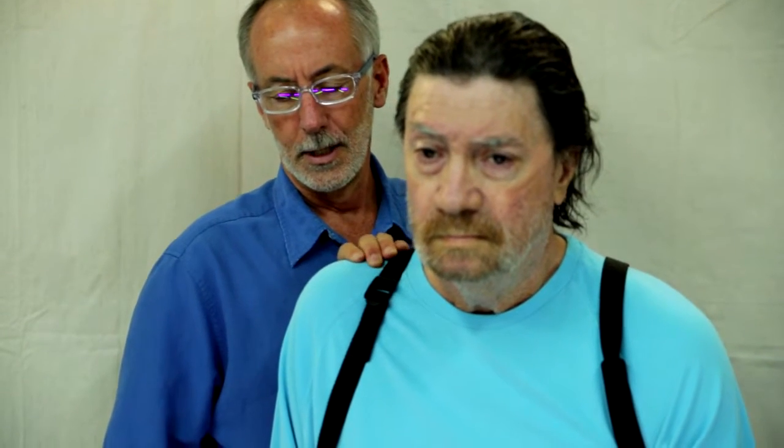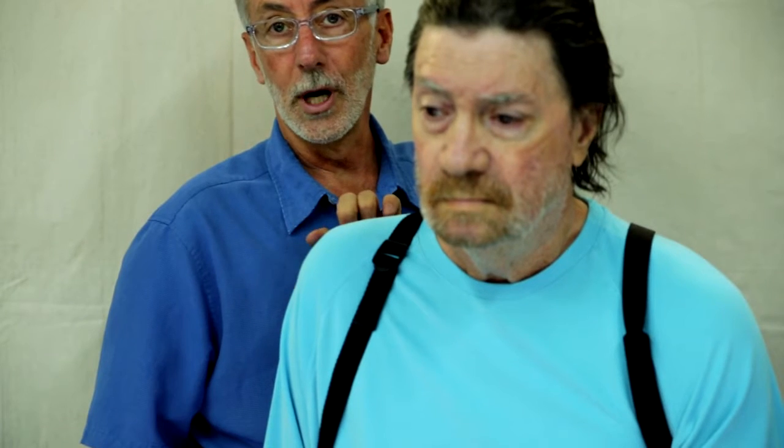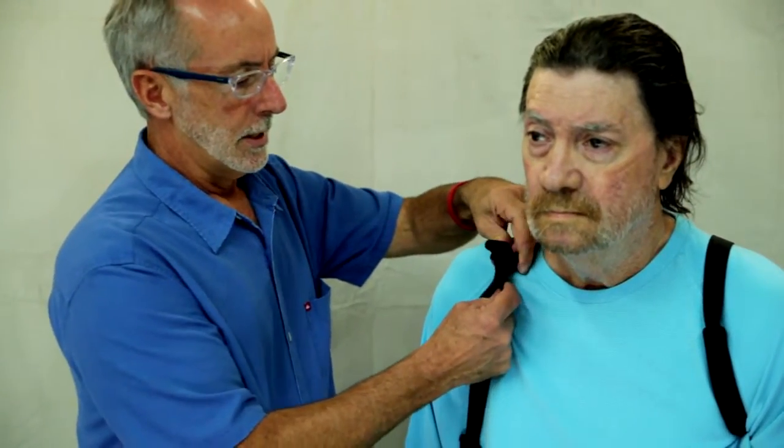This is the subluxed shoulder, and this is the reduced subluxation on the shoulder. This is what we're trying to achieve with the positioning of the Give More Sling. When we're tightening the buckles, we tighten it until that subluxation is gone.